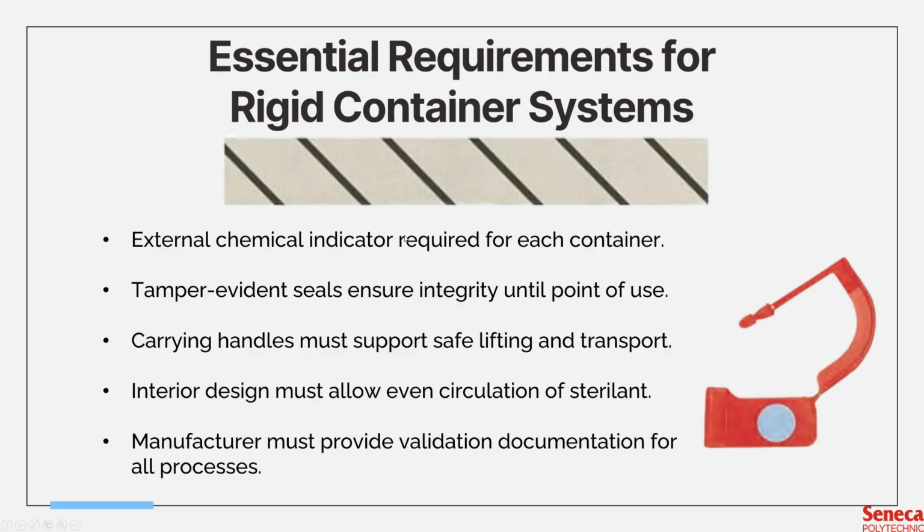When the nurses receive any instrument sets within rigid containers, they must either have a tape like this or the tamper evidence seal. Usually when you're building an assembly, it comes with a blue sticker on it. Once it goes through a sterilization cycle, this blue seal will turn black.